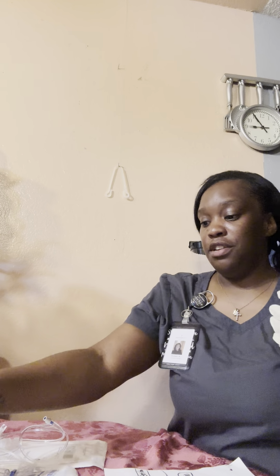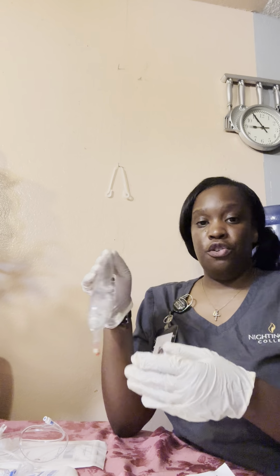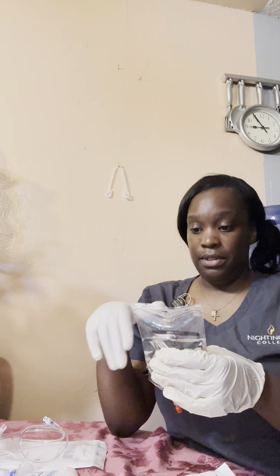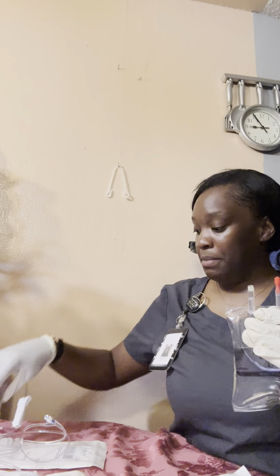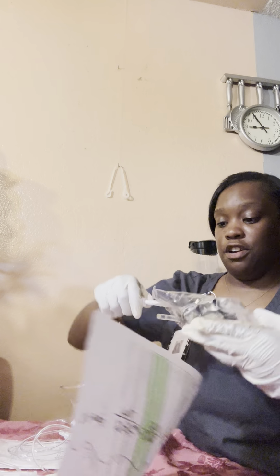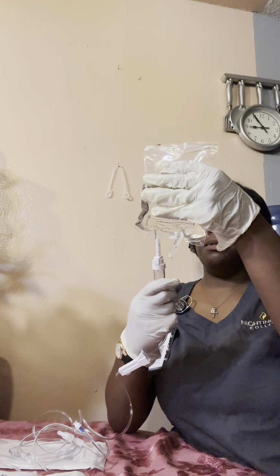All right, so you're going to start with the fluid first, and this bag is going to go under the medication, and you also want to ensure that your bags are at least 30 inches above the IV site. Okay, so you will flip the bag this way, you will take your primary tubing. You will remove this top. Remove this top. You're going to stick this in here. You're going to turn it over, and you're just going to get a little bit of fluid in here, about halfway, so you can get the air bubbles out. And then you will hang this on the lower end.